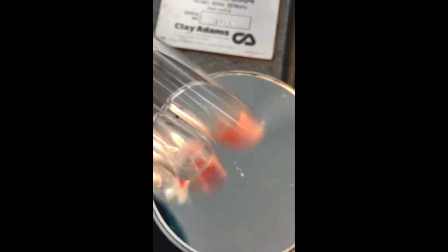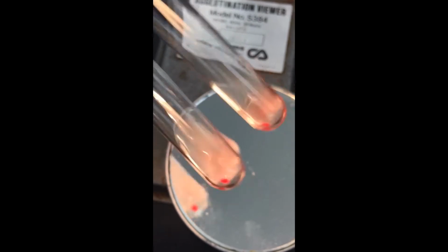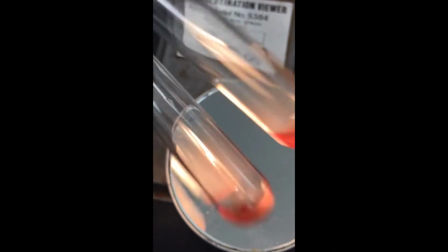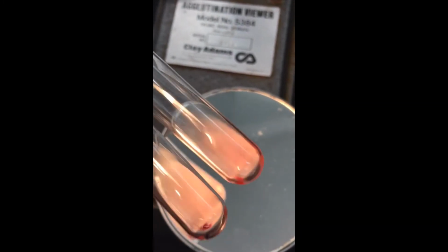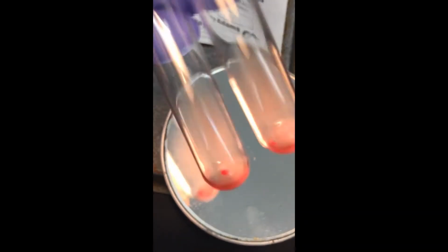Tube 7 and 8. Tube 7 is on the bottom. I don't know if you're seeing the same pattern that I am. It takes longer if I don't have reaction happening, right? Agglutination.